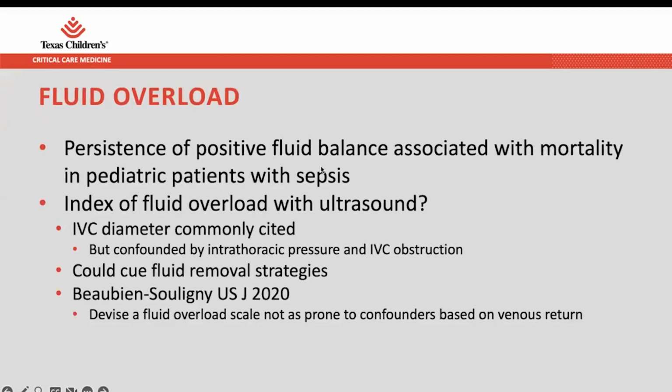So overall, we see this all over the place in terms of discussing how the critically ill patient, particularly the pediatric sepsis patient, has their overall mortality associated with their total fluid balance early on and throughout their admission. And the question as to whether or not we could use ultrasound as a way to evaluate overload and be able to quantify it and use it as a target in therapy has been raised since time immemorial.